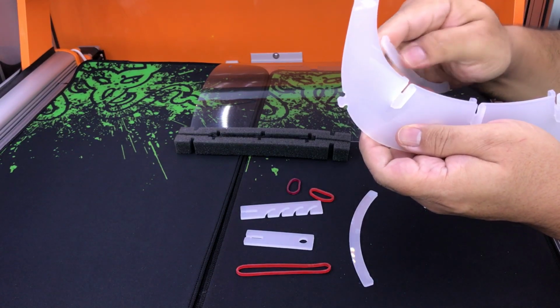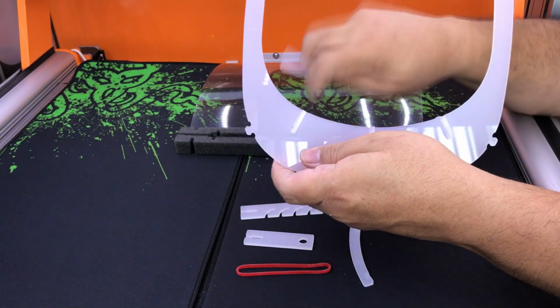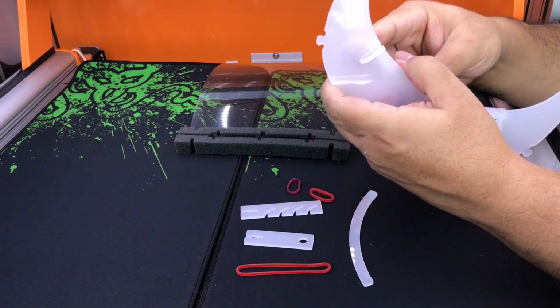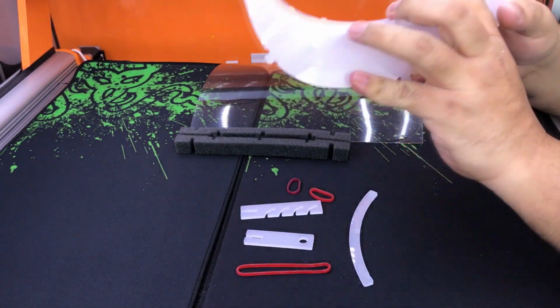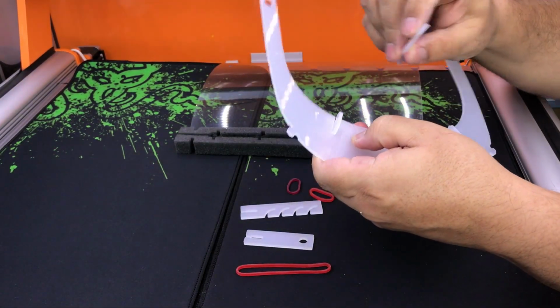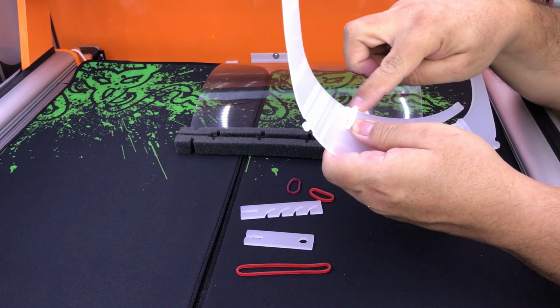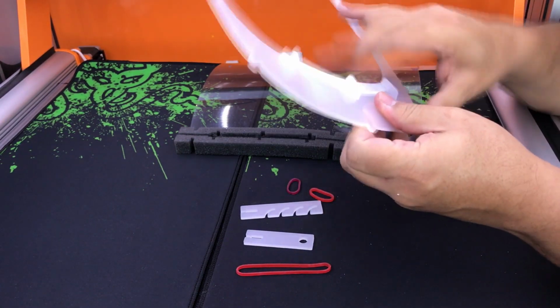So I'm going to put this pocket towards that side, so it's going to be like this. And now I can adjust this so they stay inside the pocket. And now with one finger I press this towards the other part, and I insert this part here, and it gets inside the other pocket, so it stays in place, and that's it. It's like a clip.